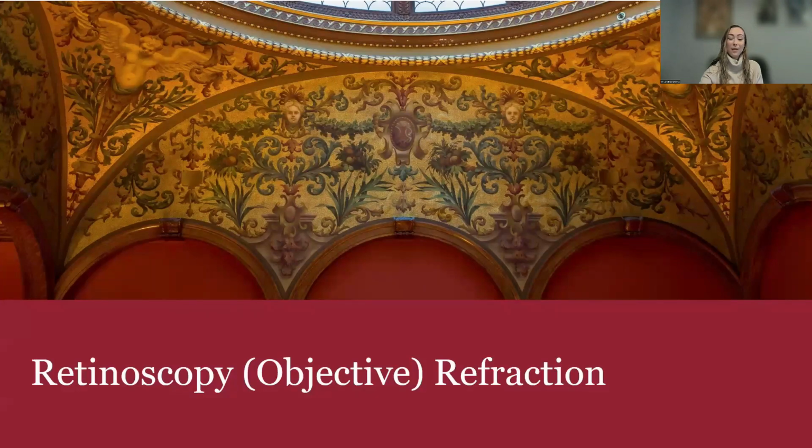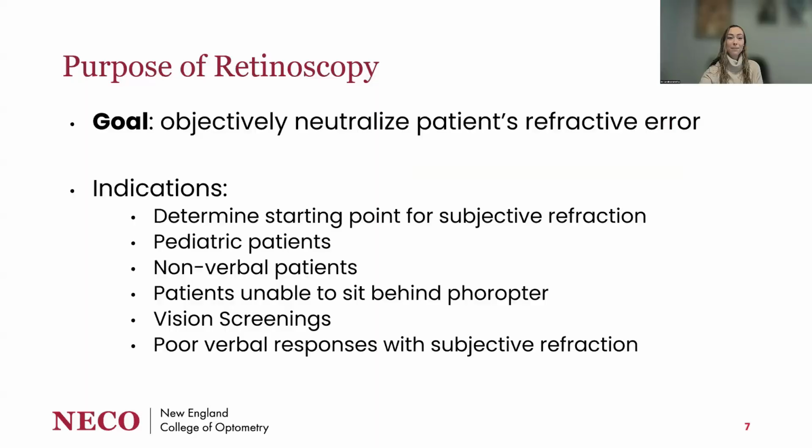First, we will be looking at the objective refraction called retinoscopy. Our goal of retinoscopy is to objectively neutralize a patient's refractive error. The key here is that it's done objectively. Our patients do not need to give us feedback on this process.